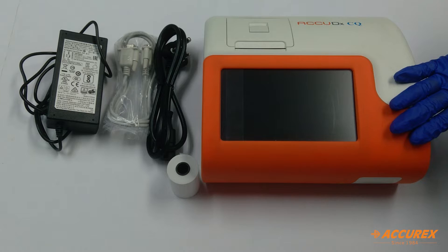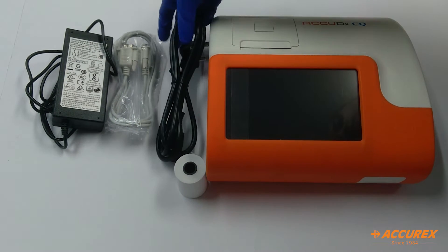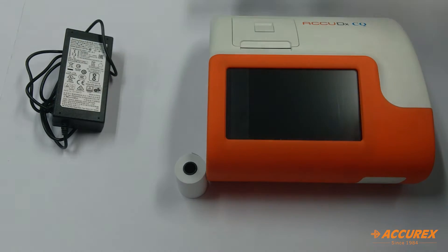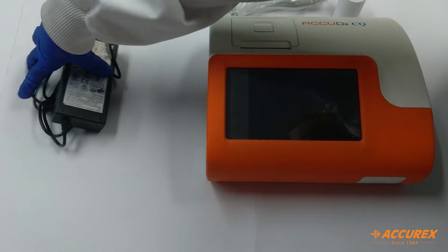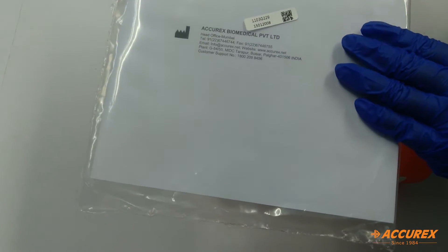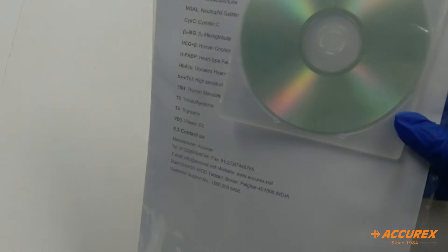Now we will see what accessories come with this analyzer. Firstly, here is the power cord, this is the RS-232 cable, this is a printer paper roll, and this is the power adapter. With this you also get the user manual, packing list, warranty card, installation report, and one CD showing how this analyzer works.